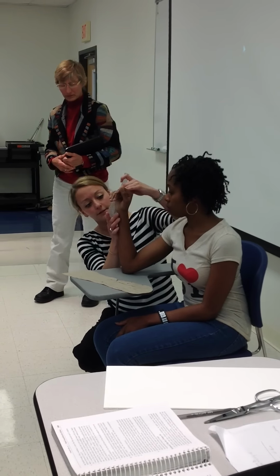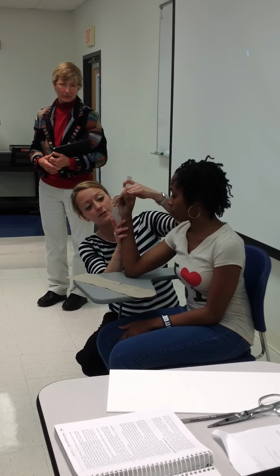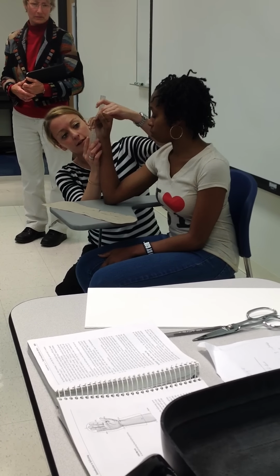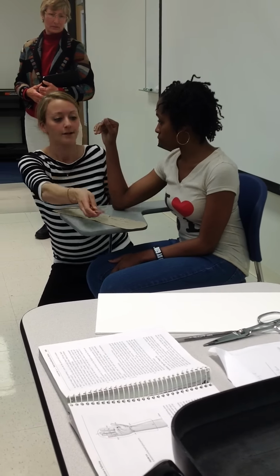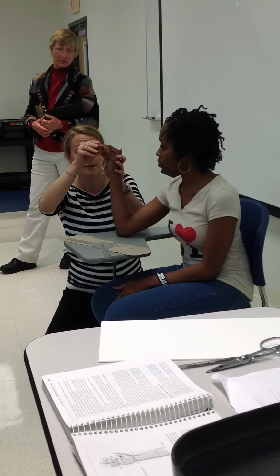me a good visual. So 20 degrees of wrist extension, right? 20 to 30? Okay. So there she's at 30. A little less than 30. If I can even, like I said, it's hard when you can't see through here. Yeah, so she's about 25 there. Good. So she's not all the way back there, right? It's about right there. And P's at 40. And P's at 40. Okay.